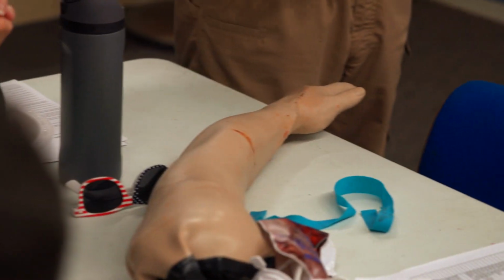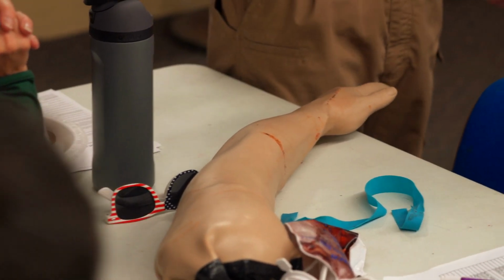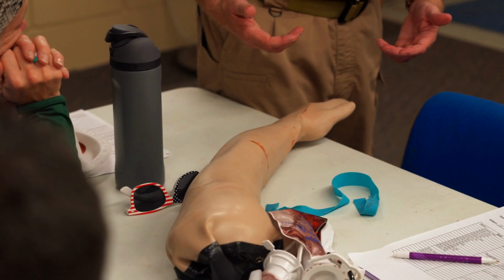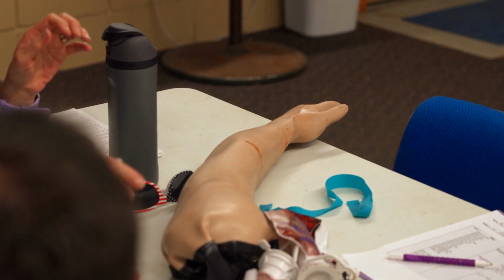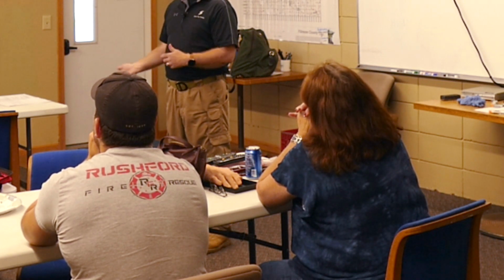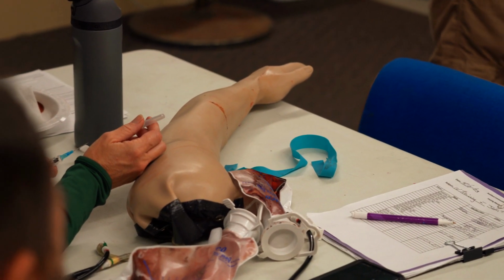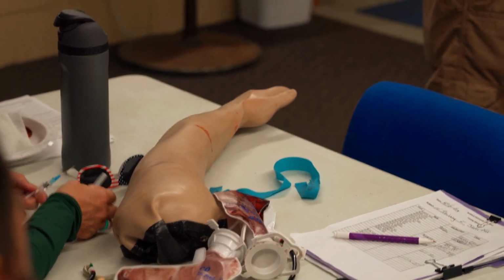But infection. So that's the other one. Phlebitis could just be irritated. That can happen, but that's not something we have a lot of control over. And then infiltration. So either we bounce off or we go through into the other side, or in some cases, they have such fragile veins, it might leak out back around the catheter. Or when we're putting enough pressure in there, it pops the vein, it might start building up outside the vasculature.